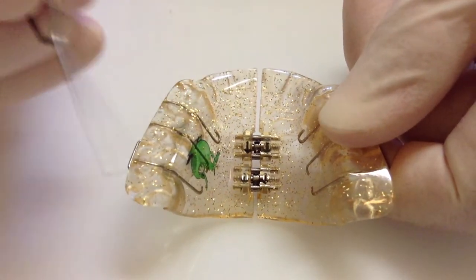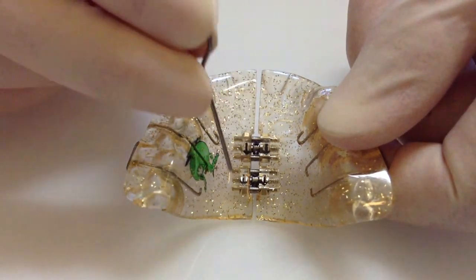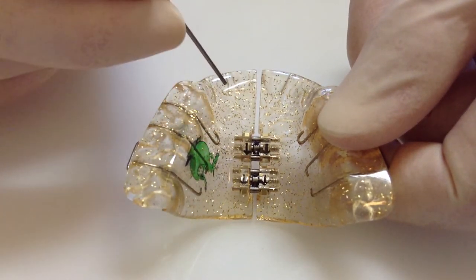You need an expansion key to expand your plate with, and you need to make sure that you're always expanding in the direction of the arrows.